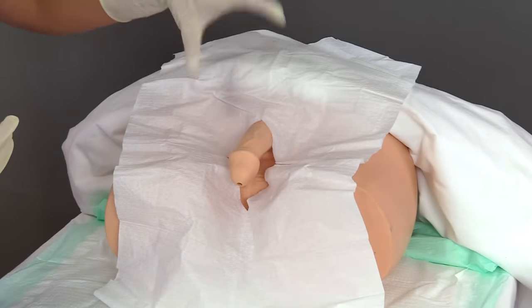Before securing the catheter, if your patient is uncircumcised, take the foreskin that you had retracted and place it back into position. Then remove and discard the draping per your facility's protocol, and get the patient covered up.